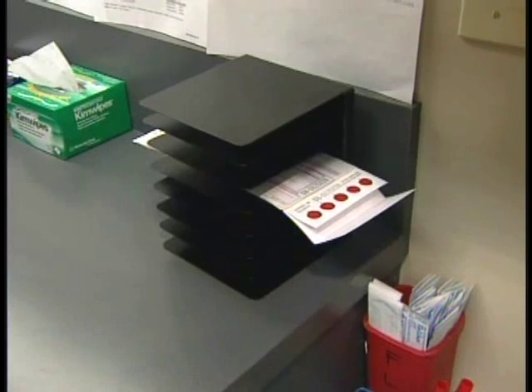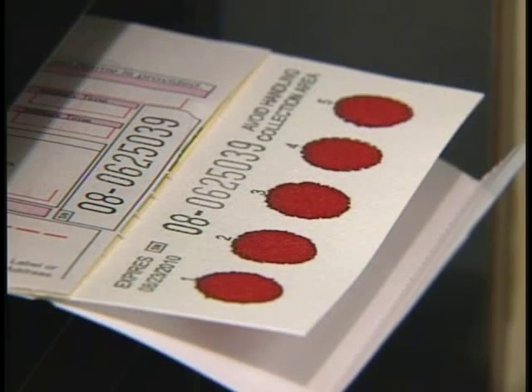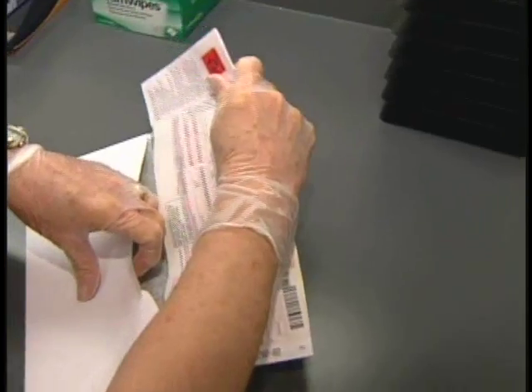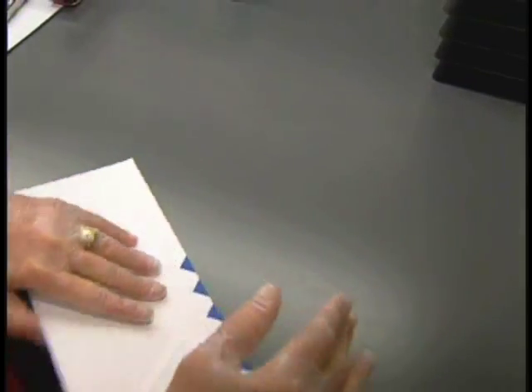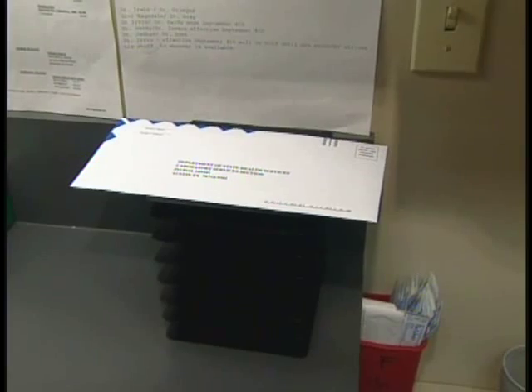Let the blood spots dry on a clean, flat, non-absorbent surface for a minimum of four hours. Place the completed collection form in the special envelope that came in the specimen collection kit and mail it to the testing laboratory within 24 hours of collection. It's crucial that the form be mailed no later than this.